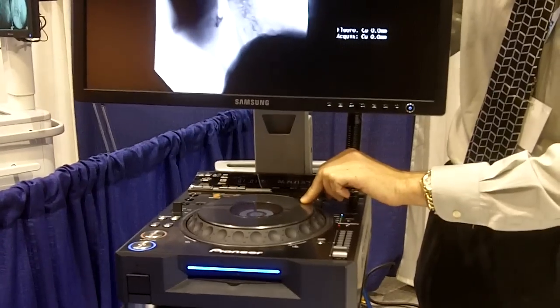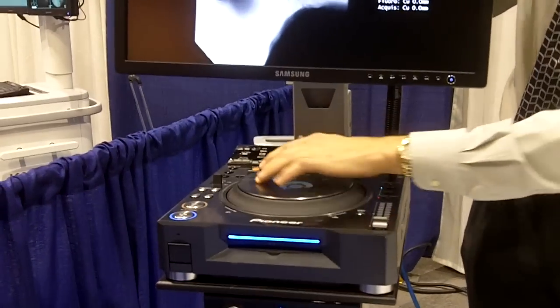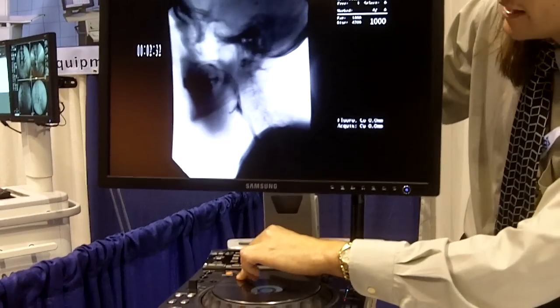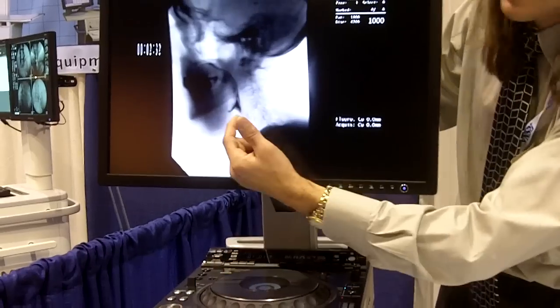They can throw it into this turntable. It's a turntable made from Pioneer. And they can review the video very quickly, find what they're looking at, and they can very intuitively move the wheel forward and back and be able to review the case. That's it.